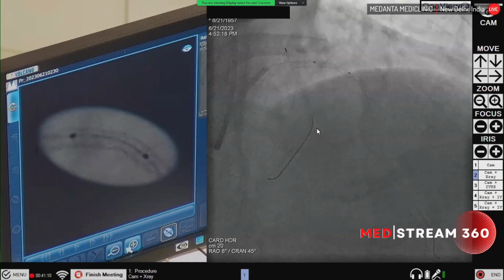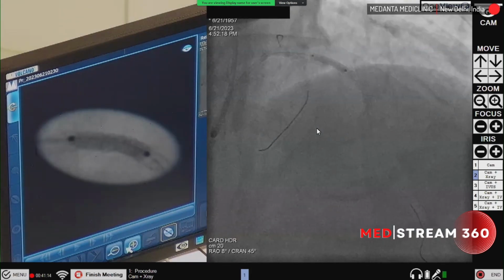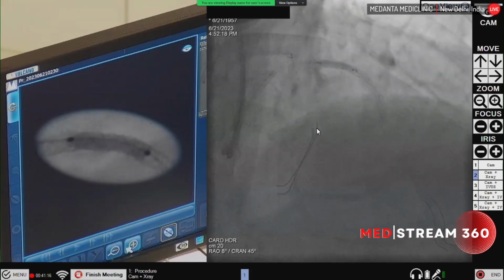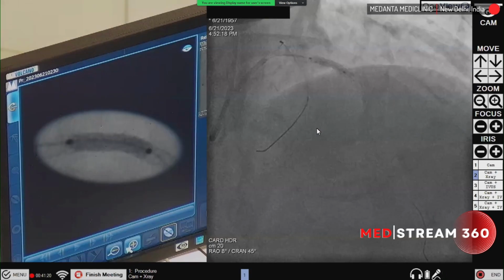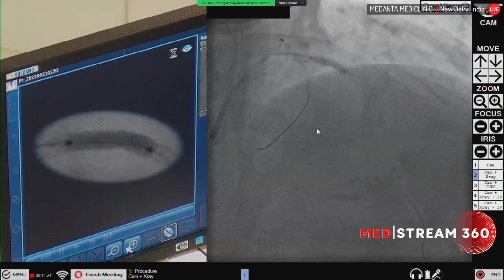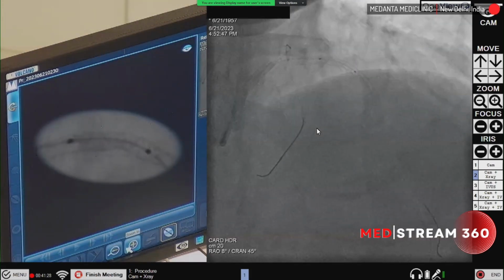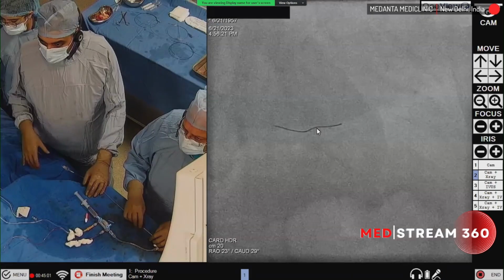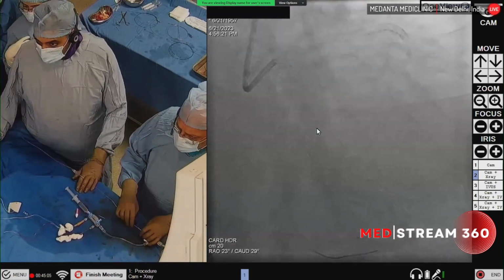Go up 2, 3, 4, and you can see on the stent boost. This is a line online stent boost from Volcano. How much? 12. Yes. 14. Okay, deflate. Okay, so stent looks very well expanded. Center solution central, please.